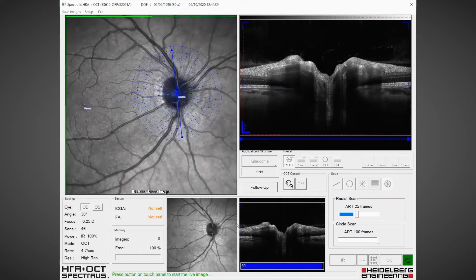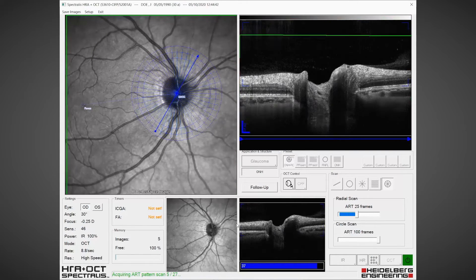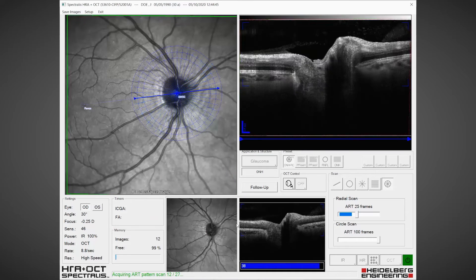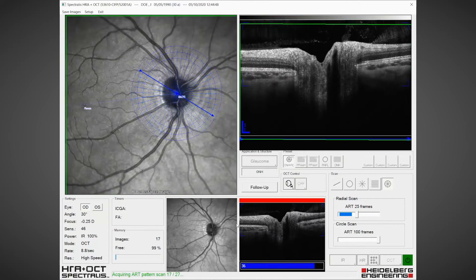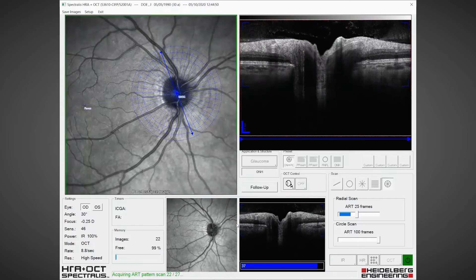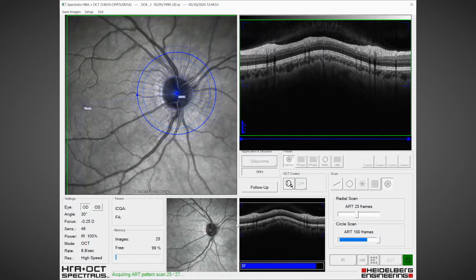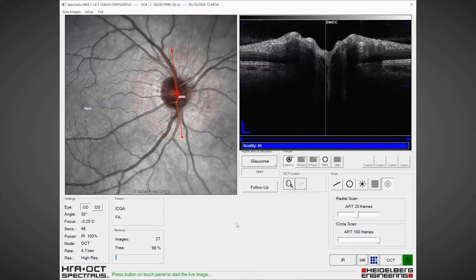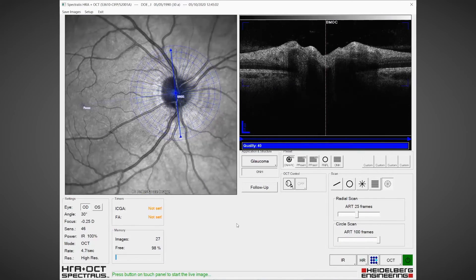We acquire the image again: 24 radial scans, 48 locations of Bruch's membrane opening, and three nerve fibre layer circle scans. Each circle scan has ART100, an averaging of 100 scans, which provides very high quality contrast and detail.